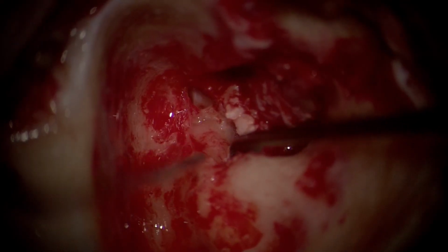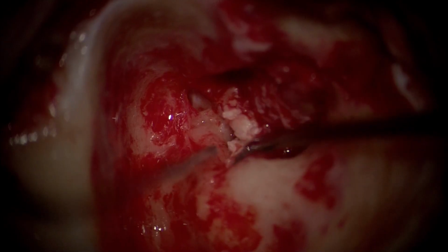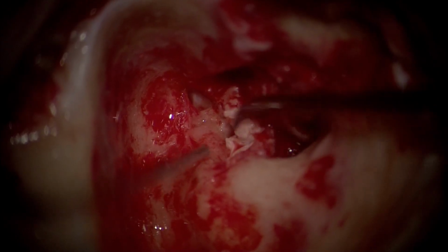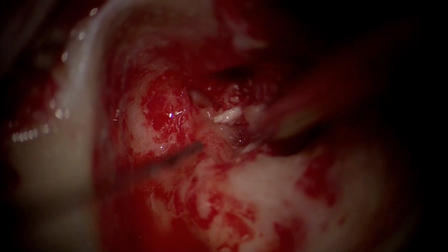So now you see you have the landmarks in the picture. You have the lateral canal bulge right in front of you, and now we are very gradually, with very measured movements, dissecting the epithelium from the facial nerve. You're seeing how in between we use either scissors or a sharp dissector like a sickle knife, and not a blunt dissector, because we don't know the status of the facial nerve, and we certainly do not want a lot of traction on an intact or dehiscent facial nerve, because that can lead to some paralysis, even if it is transient.